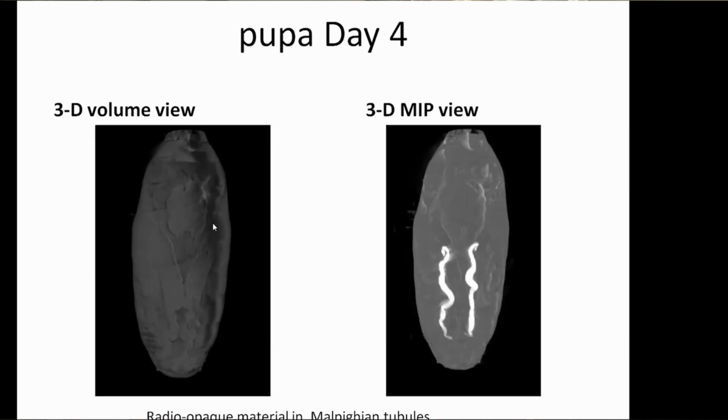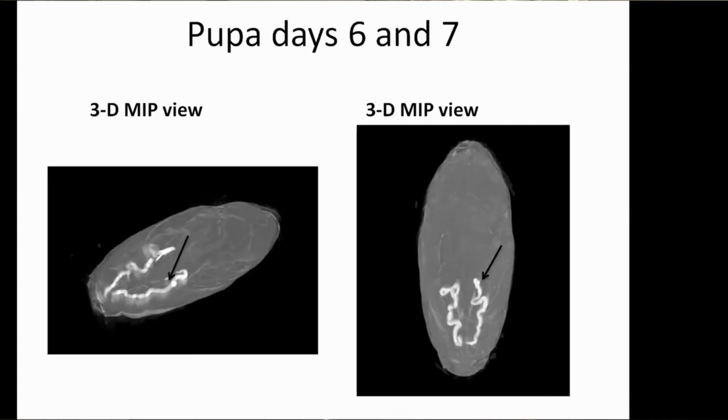So here we are at day 4, still all in the Malpighian tubule. Here we are at day 6 and 7, still all in the Malpighian tubule.